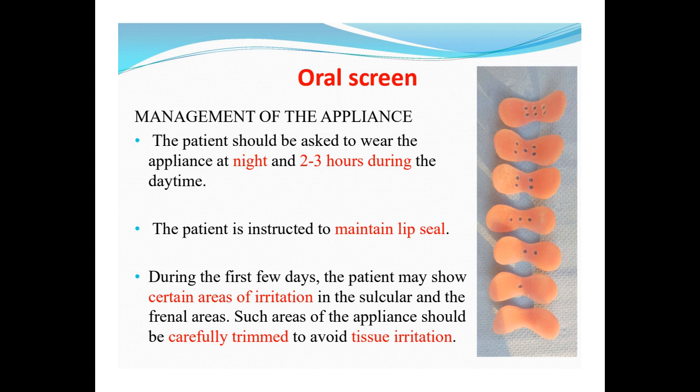Now what do you see in this picture? The same oral screen is having different types of holes. Imagine giving an oral screen to a child who has been doing a continuous mouth breathing habit. Can they correct this habit within one day? It's not at all possible. They cannot breathe through their nose in one day. You have to gradually stop the habit. So that is what is shown in the picture.